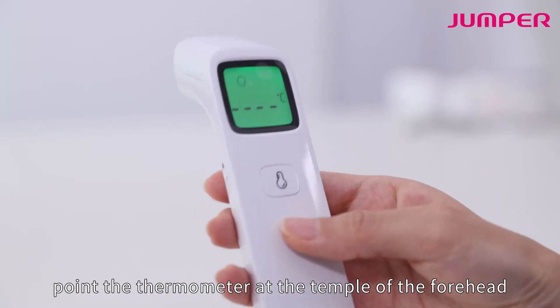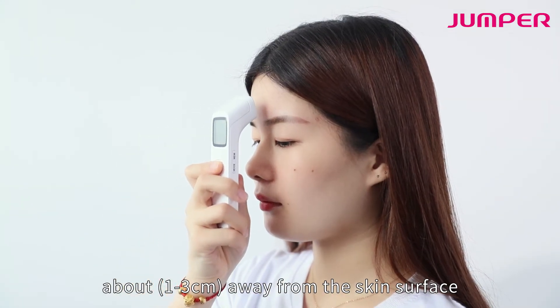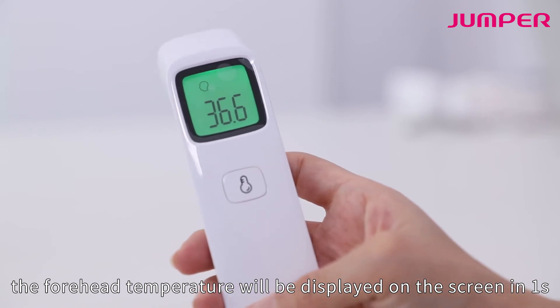Point the thermometer at the temple of the forehead, about one to three centimeters away from the skin surface. Press and release the measure button — the forehead temperature will be displayed on the screen in one second.